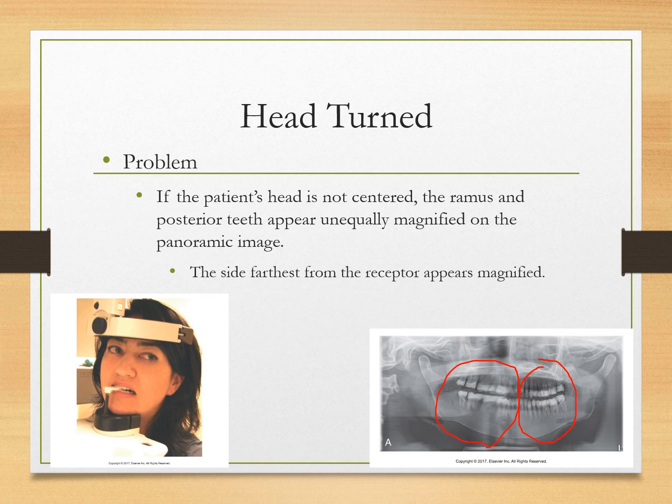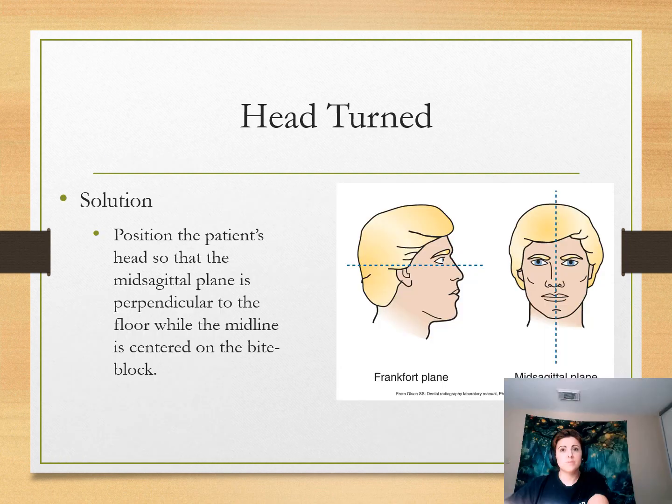If your patient comes in crooked, which I don't see too often, usually once you go in there, there's a little mirror and a little light and people automatically line themselves up most of the time. But it's important for you to make sure that the light is centered right down the center of their face. The solution for that problem is to make sure that this mid-sagittal line, this is a terrible line, centers the patient.